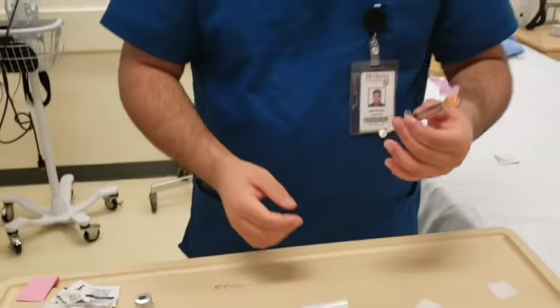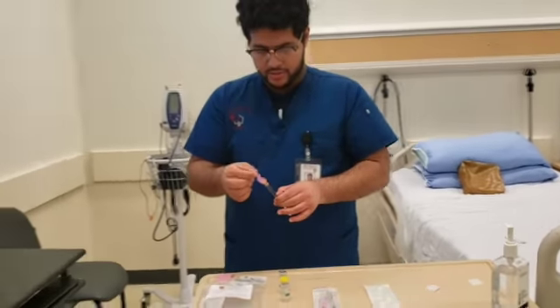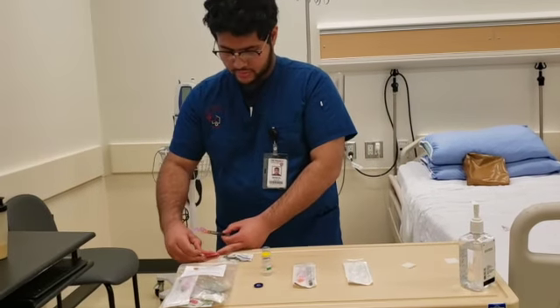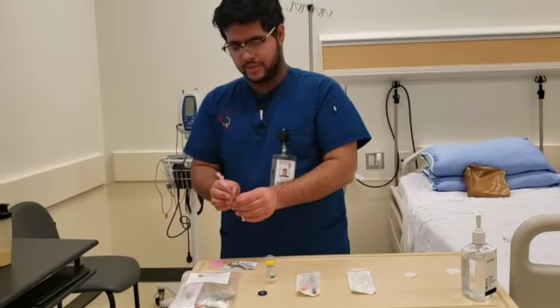Now since this is prepared, we're going to keep it just on the side. And we're going to label this as heparin. We don't want the medications to be getting confused.